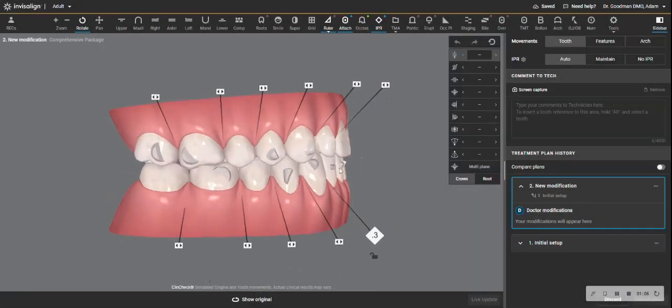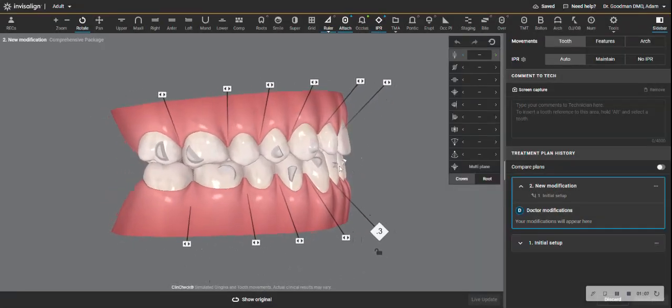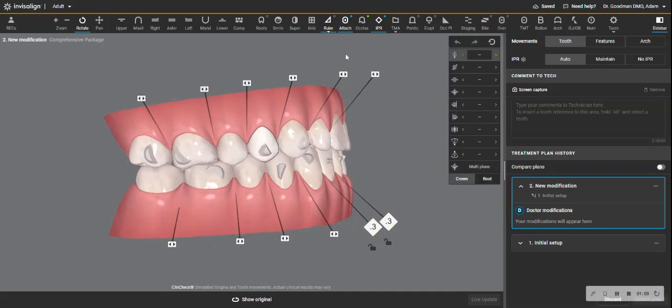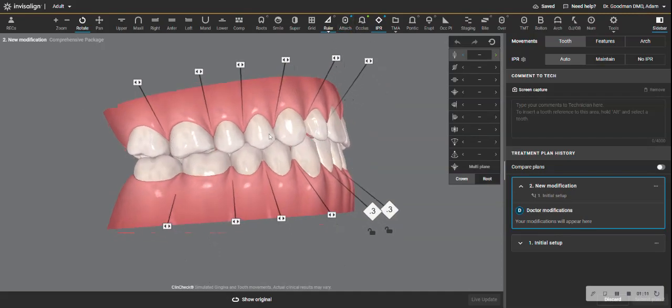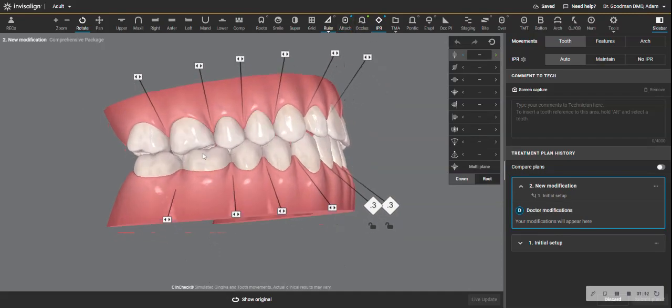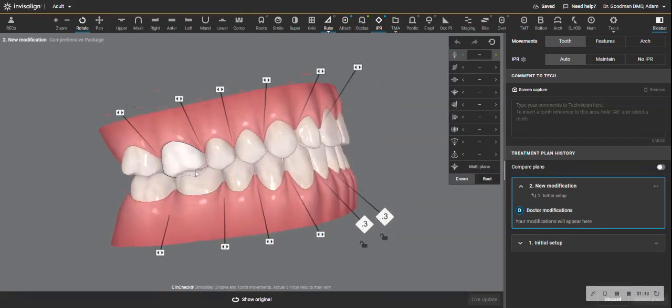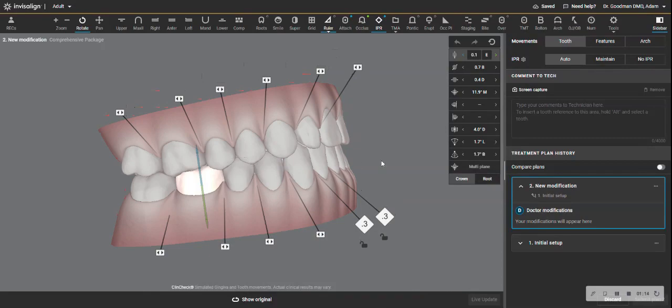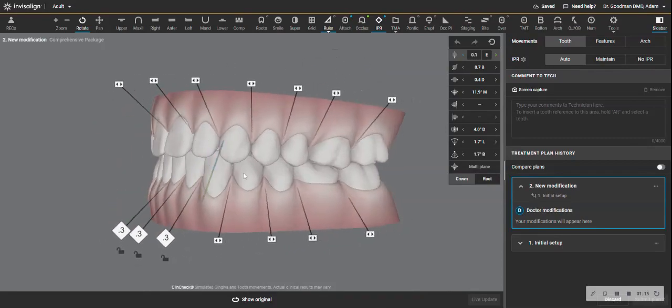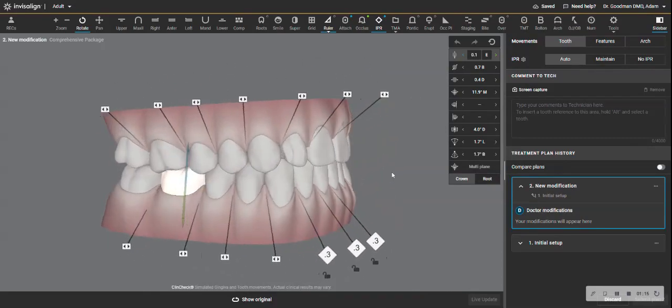All right, now, first thing is this occlusion. First, I'm going to take the attachments off so I can see better. This occlusion right now looks fine to me, and the patient reported no issue.